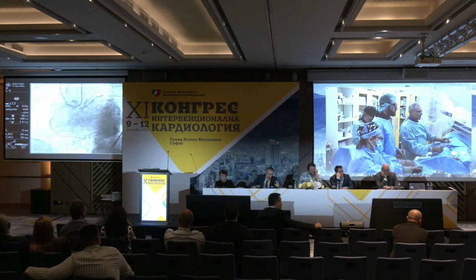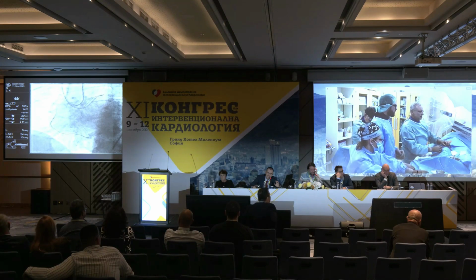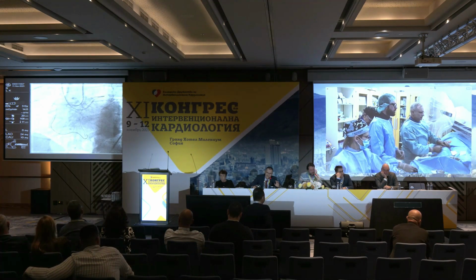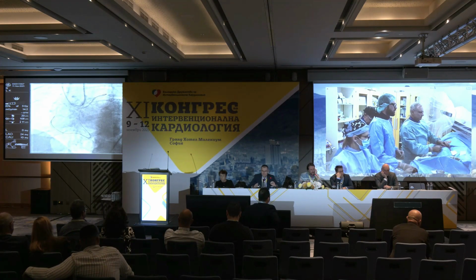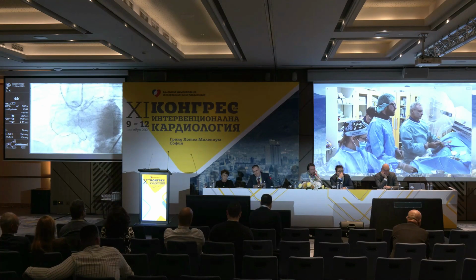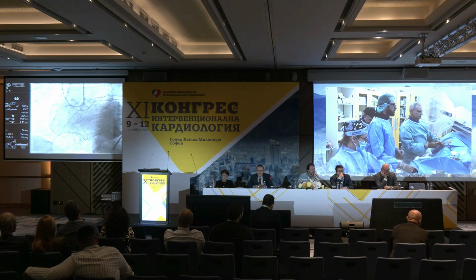That was what Gaia... I'm losing. I'm going to advance a little bit to get a little more microcatheter. Yeah, you will kill the monster. We are sure of that. Just for curiosity, why in that subintimal position, where you had a good course and knew where the vessel was going, didn't you puncture antegradely? And we will. Yeah, we will.